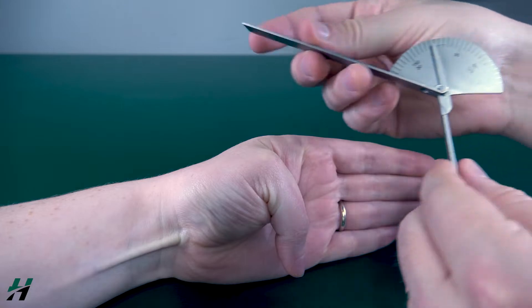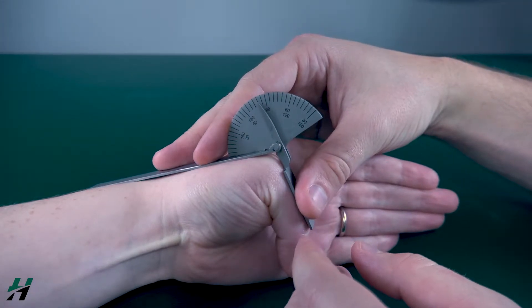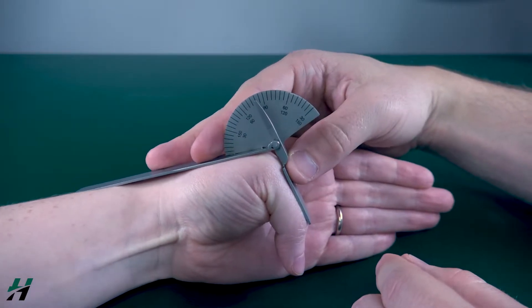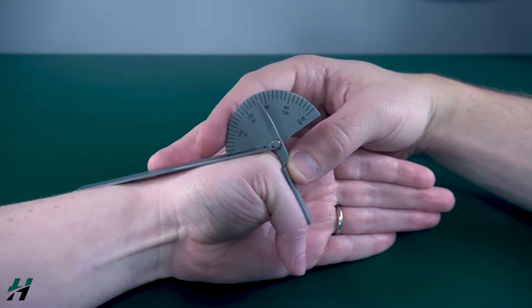This thumb is about 80 degrees of flexion at the MP joint. That's a little bit more irregular, but it's just kind of neat to see that not all joints are similar.